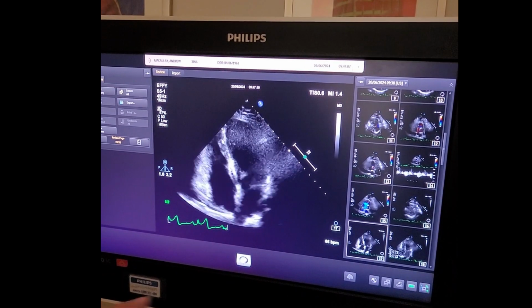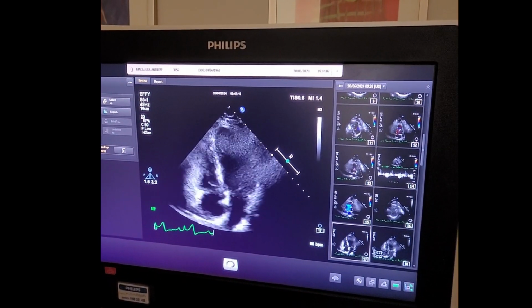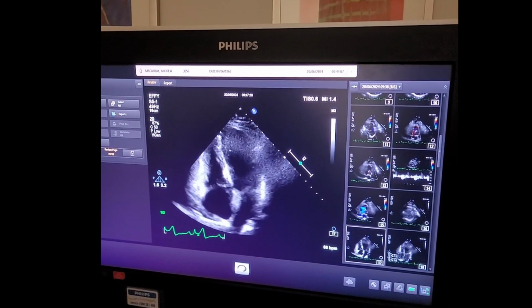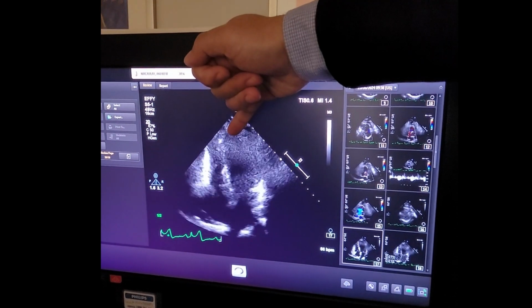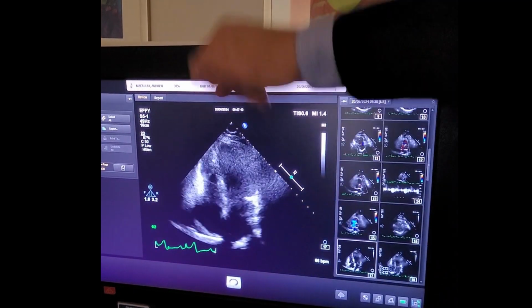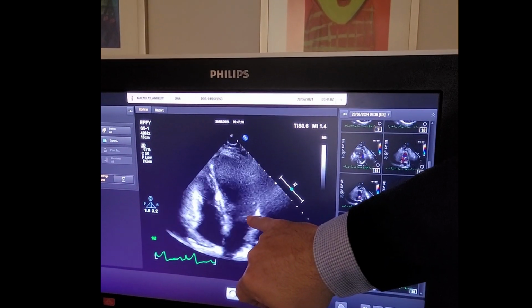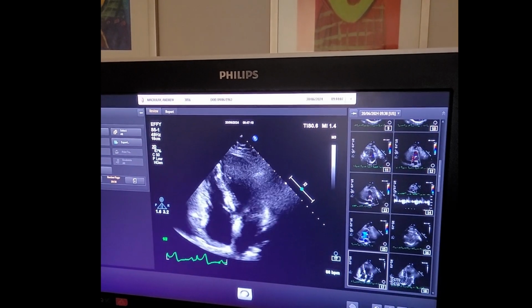Yeah, that's your four chamber. Take a picture. Well, don't move your finger out of the way, Adrian. Yeah, sorry. Right, I was educated. So, left chamber, that's where the probe is. Yep. Left ventricle, left atrium, right ventricle, right atrium, mitral valve, tricuspid valve.